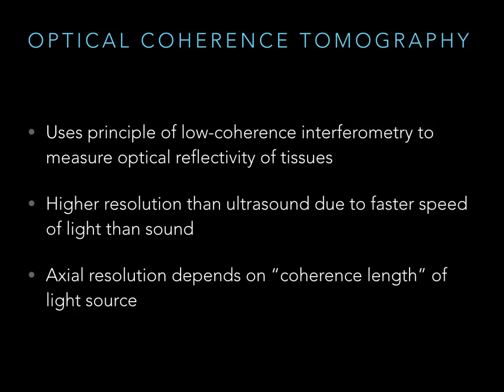It is a non-invasive, non-contact imaging modality that produces micron resolution cross-sectional images of ocular tissue. In my case, I care about the retina and choroid. It also does optic nerve, cornea, lens, all sorts of other things, and it's used in other fields as well. It's based on imaging reflected light.